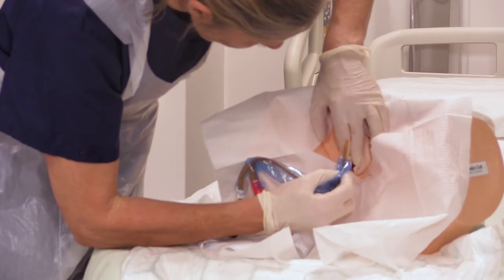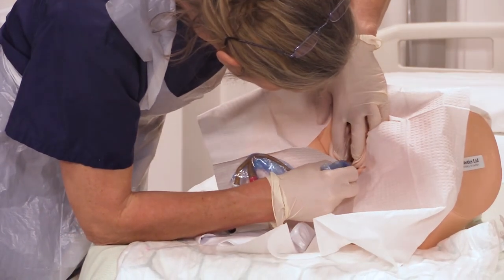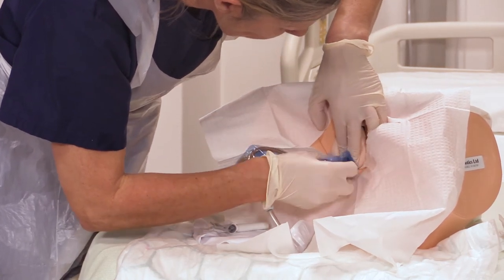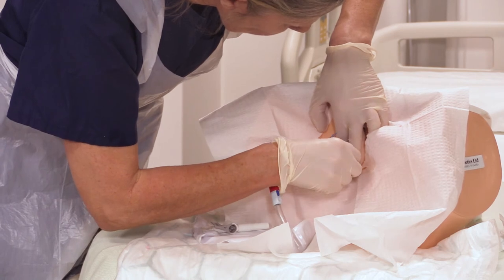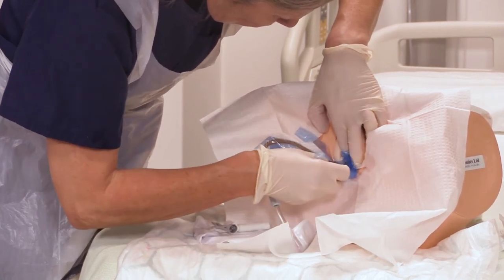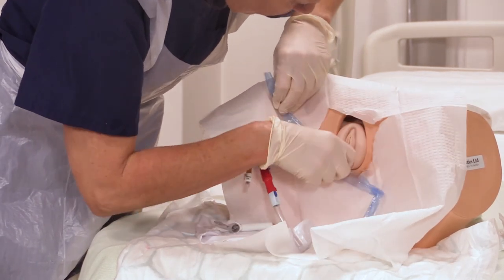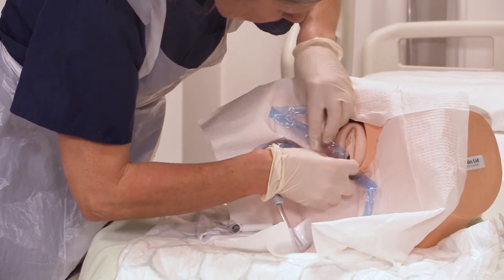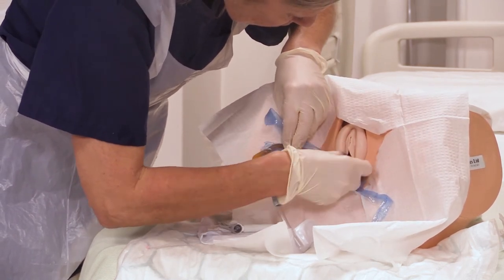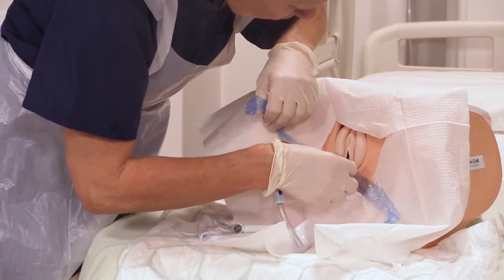Hold the catheter in your dominant hand and gently feed into the urethral orifice. While angling the catheter slightly upwards and backwards, pass it into the bladder. Insert about 5 to 6 centimetres. If the patient complains of pain or there is any resistance to passing the catheter, stop and ask for medical advice.